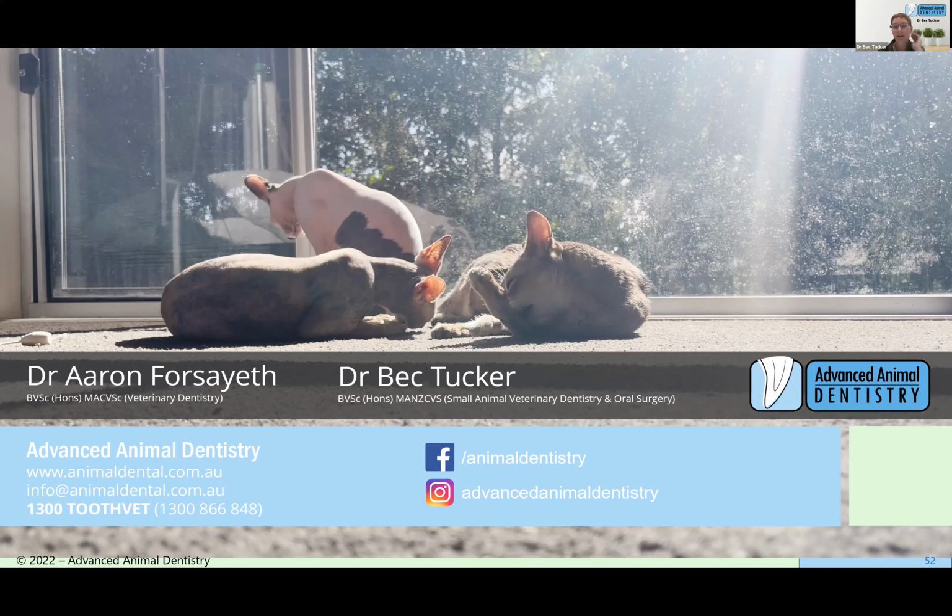Tips for keeping the incisor straight when in lateral recumbency. I use basically the prop to get the head up a little bit off the table. So I will usually tilt the nose up with something, and then I'll squat down and have a look at where the right angle is. I think if you're standing above them when you're trying to get the image, you'll often inadvertently rotate up or around that lateral plane around their head.